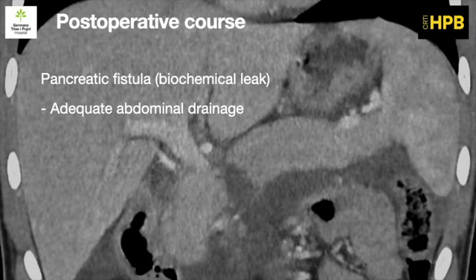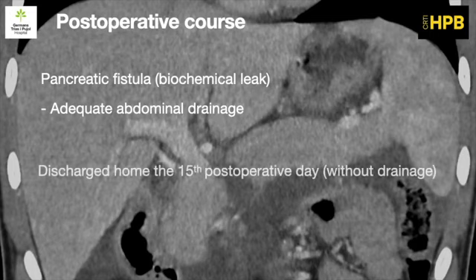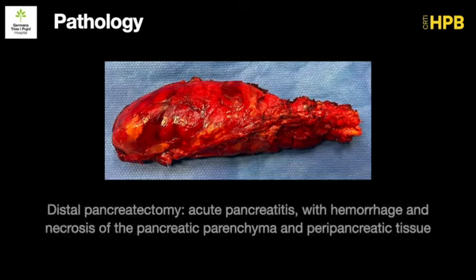In the postoperative course, presented a biochemical leak treated with an adequate abdominal drainage. It was discharged home the 15th postoperative day without abdominal drainage. Pathology confirmed an acute pancreatitis with hemorrhage and necrosis.